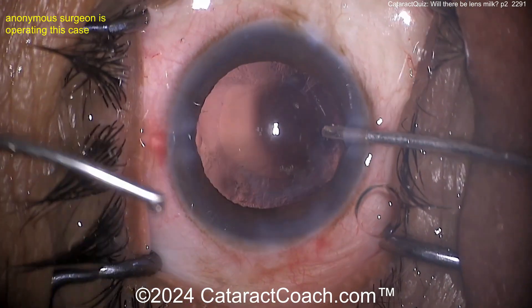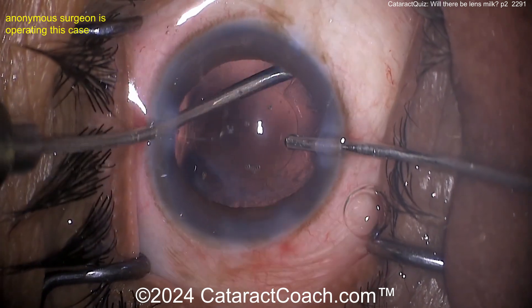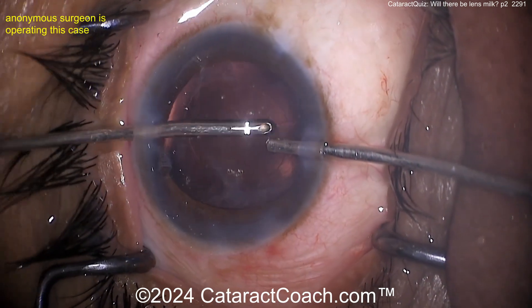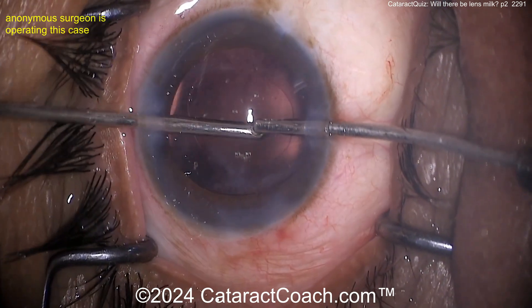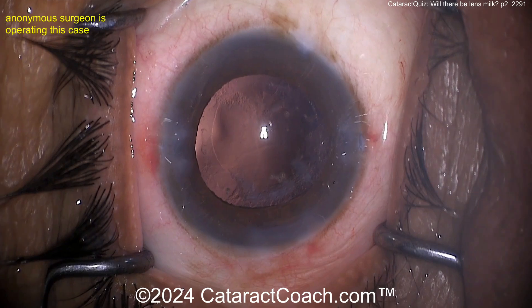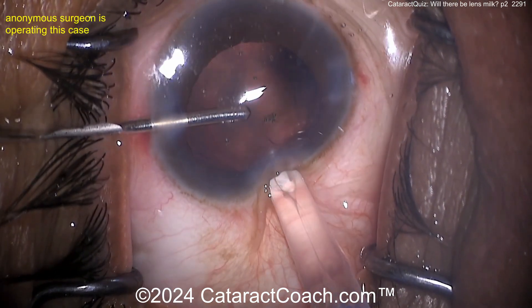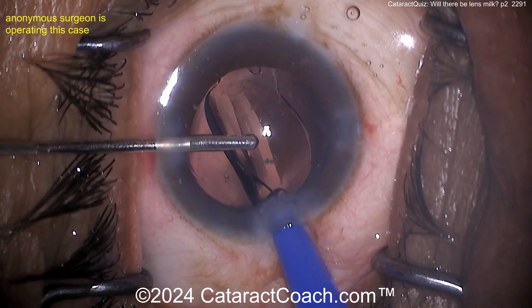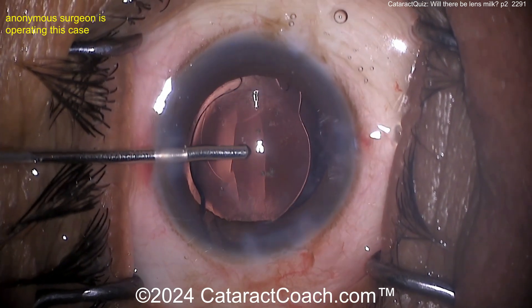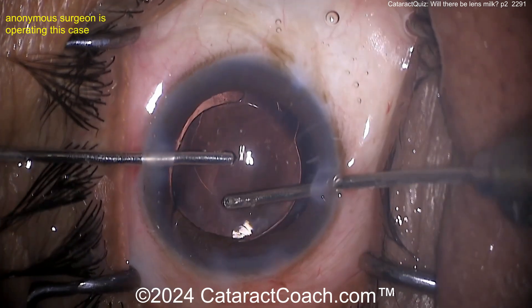Cleaning up here very nicely by manual I/A — look at that, not a whole lot of cortex remaining. A lot of it was liquefied. Finishing up this case, it's a very nice case. Here comes the lens — single-piece acrylic lens going into the capsule bag. Looks pretty good. Get that trailing part of it dialed in.